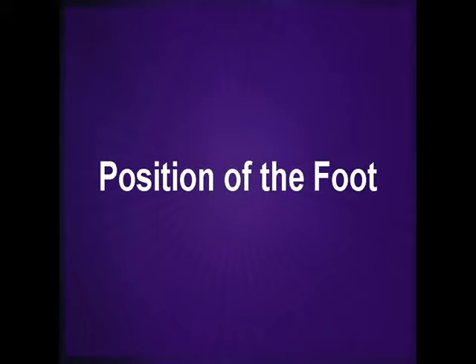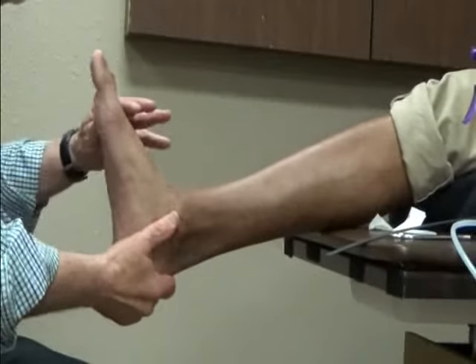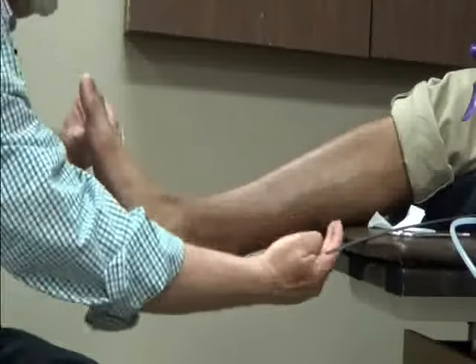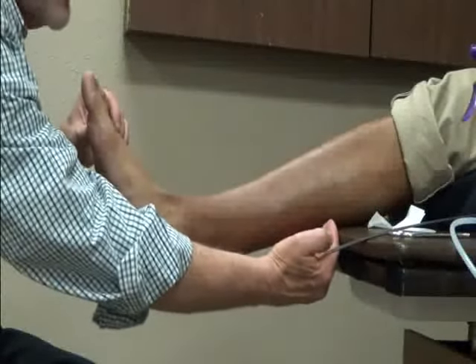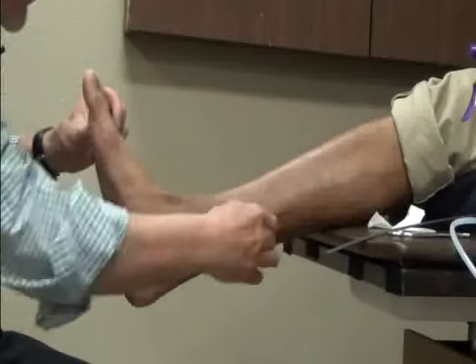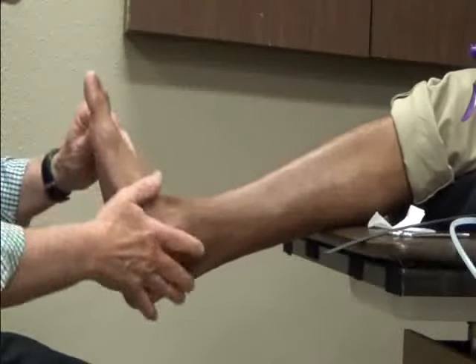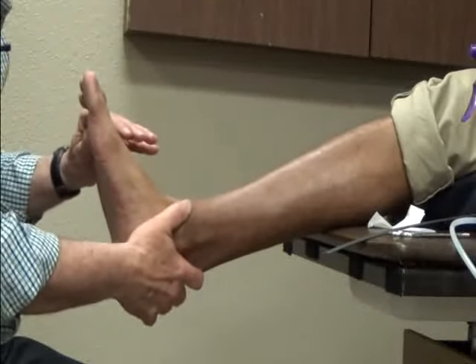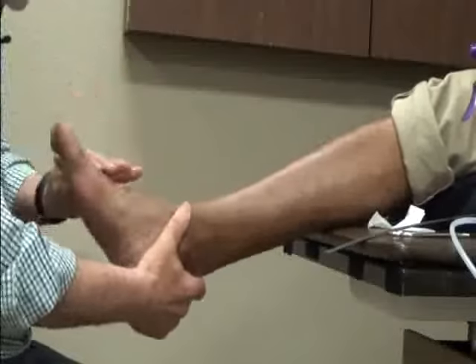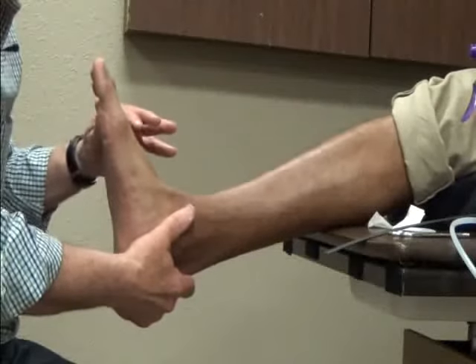It is essential that before you apply the casting material, you first evaluate the foot and position the foot as if you were casting. It is important that the knee is slightly bent. A small pillow underneath the knee assists in this effort. The foot should be hanging over the table by at least 18 inches. You should attempt to put the foot in its neutral subtalar joint position with the mid-tarsal joint locked. The ankle should be placed at 90 degrees, and be sure to notice that the hallux has not gone into a plantar flexory position.